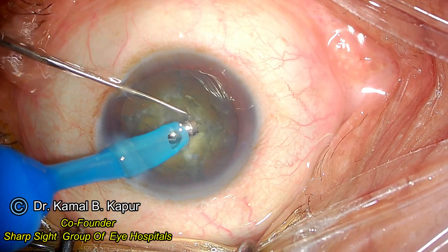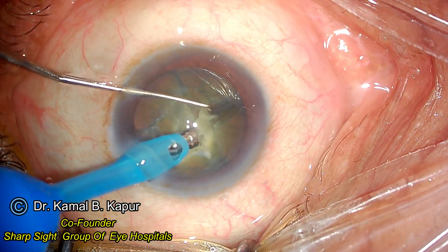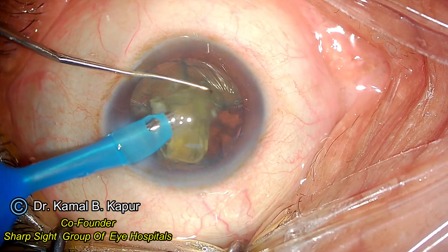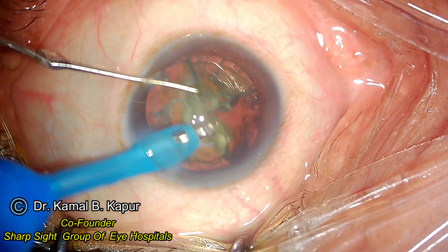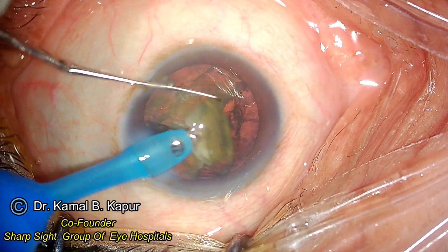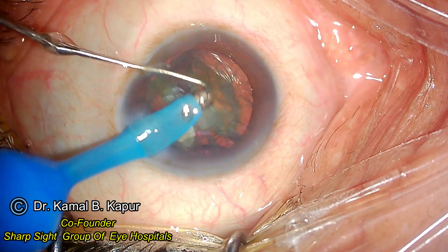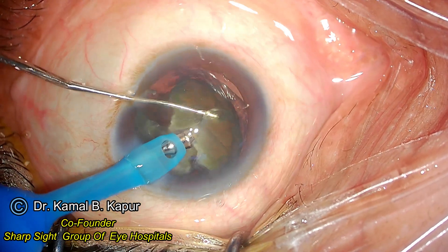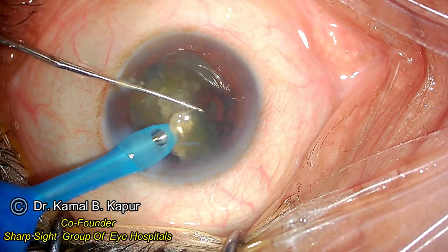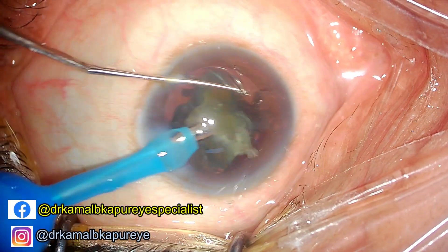Again embed in the center part of the nucleus, embed your FACO tip in front and separate. You now have four quadrants created out of a vertical chop, and the whole process is covered within a matter of a couple of seconds. Knowing your vectors — where to embed your FACO tip, where to embed your FACO chopper, and what the vectors of separation are — will make the job a lot easier. If your FACO tip is not embedded at adequate depth and your chopper also is not penetrating to adequate depth, your chopping will be ineffective and you will have an incomplete chop.